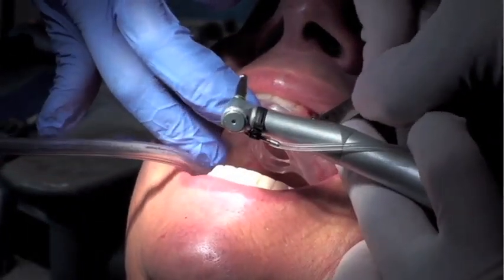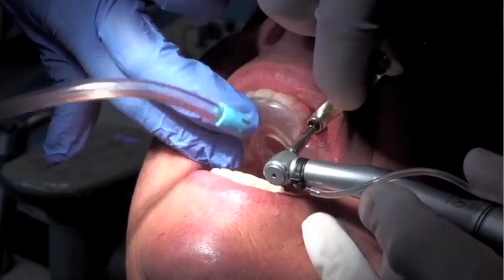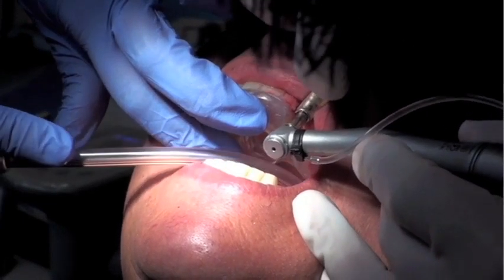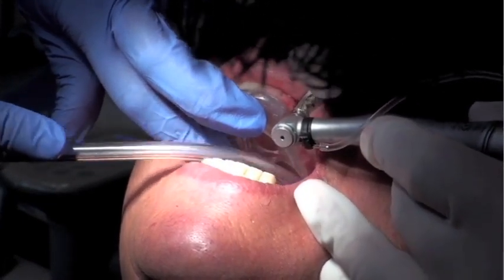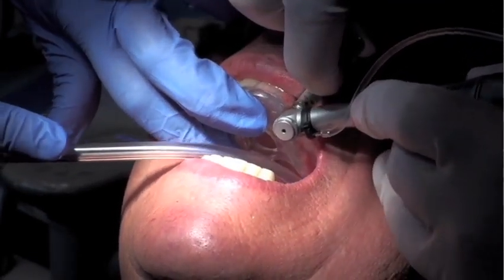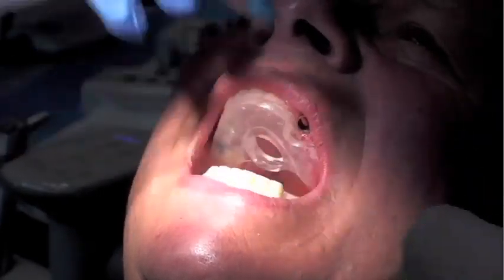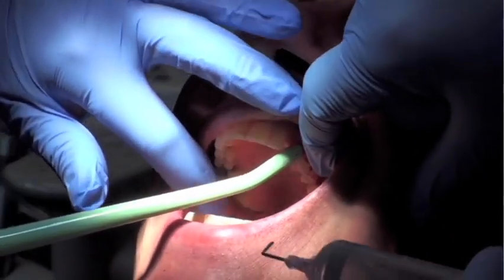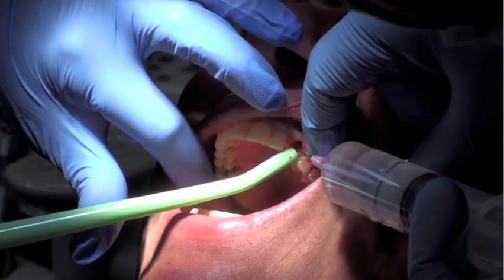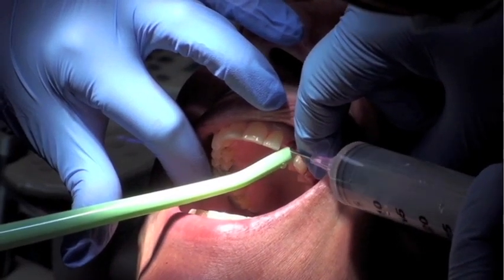In a surgery like this there is very little room for error. In fact, because the ridge width is only 4.5 millimeters, that leaves me half a millimeter on either side of the implant. Free-handing this implant would be virtually impossible. I've shared this case with several surgeons in my hometown and they each tell me that a surgery like this would be an hour and a half easy using conventional methods. Start to finish, we were finished with this patient including attachment of the final prosthesis in less than 20 minutes. Heavy irrigation to remove any tissue tags that may be displaced at the base of the osteotomy.